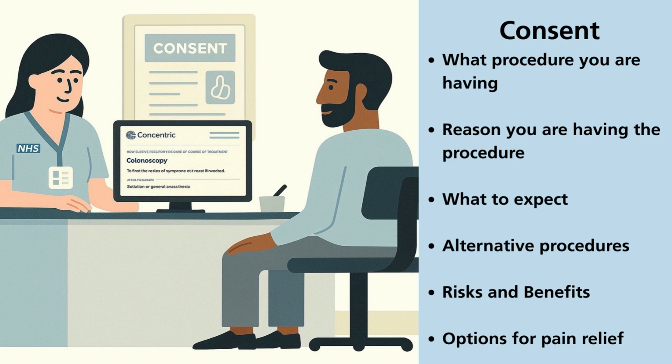You will be sent a consent form for your procedure through email to read. There are links which include further information regarding your procedure. It also includes the risks and benefits of your procedure, options for pain reliefs, and the alternatives to your procedure. It is important that you read this form carefully, and if you have any questions, the nurse admitting you for a procedure will go through these on the day.